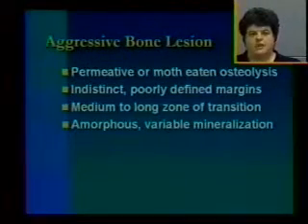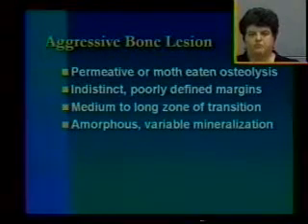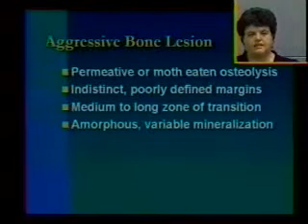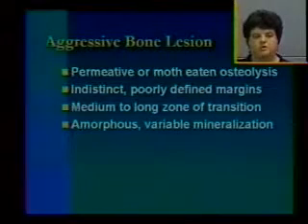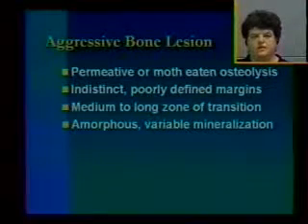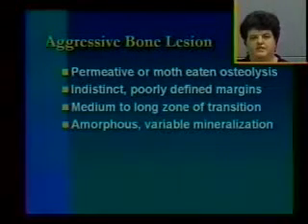So getting on to abnormalities of bone, the key in bone is to decide if there's too much or too little bone, and then, if there's too much, whether it's an aggressive lesion or a benign lesion. To determine if something's aggressive, the characteristics of aggressive bone lesions are osteolysis and bone production. The appearance of this osteolysis and new bone formation is what's going to key you off to the degree of aggressiveness of the particular lesion.